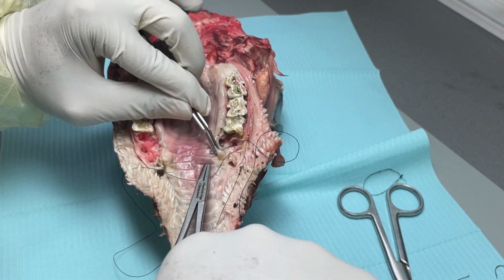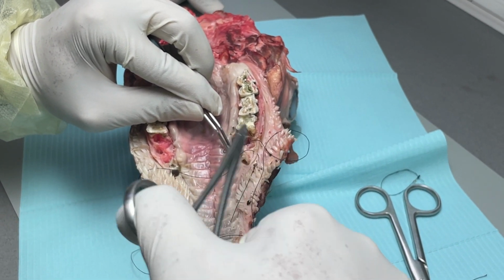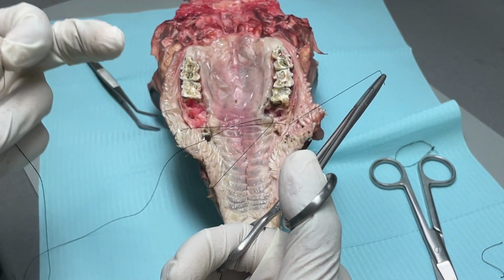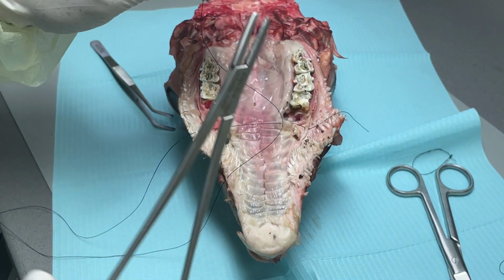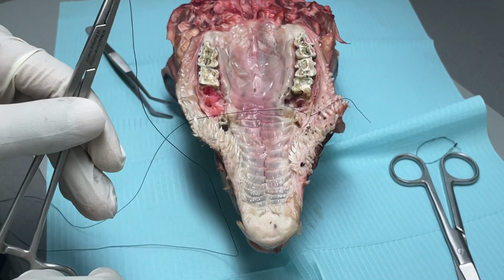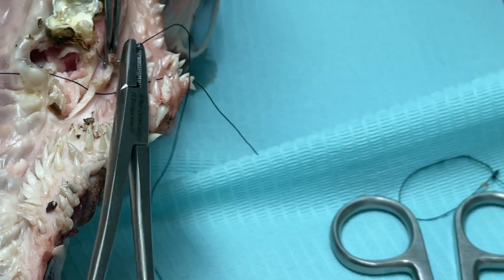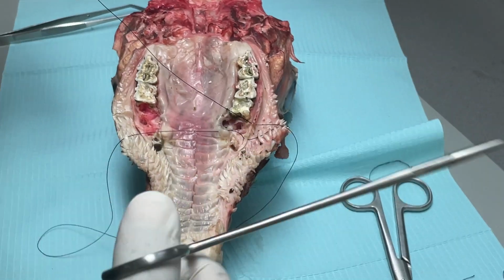See, you can come either like this, or I can go here also, and then I can go here, come here, and then tie here, or I can do like this, where I will come in like this. Lift it from here. I can do this, then I can go across. Just back. External surface. That's called the loop, right? When you come from the external side each time, that's a loop.